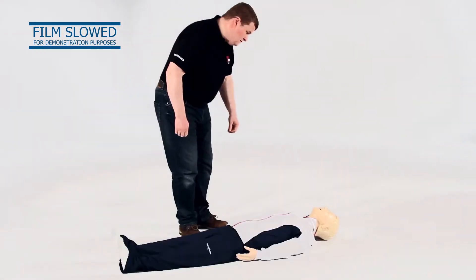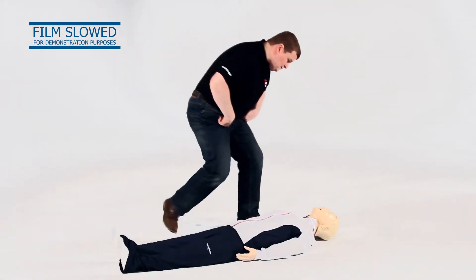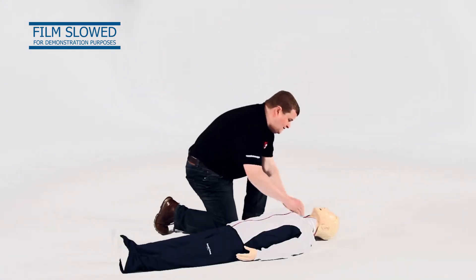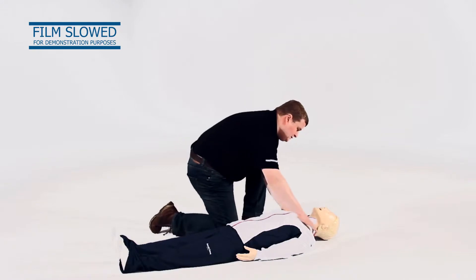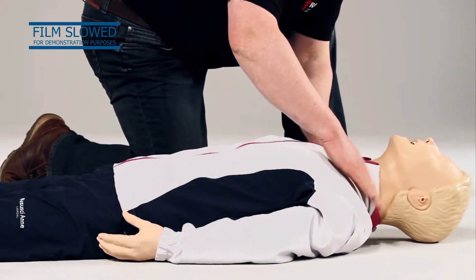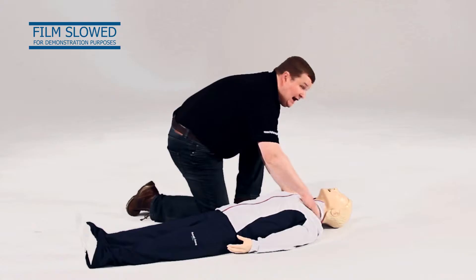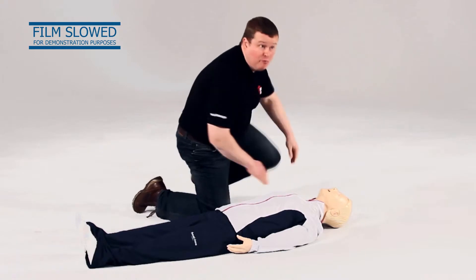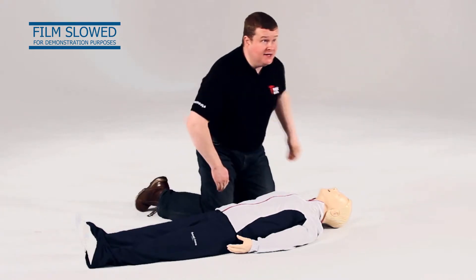Carefully assess to see if the casualty is responsive by shouting at them: 'Are you alright?' and by gently shaking them on their shoulders. If the casualty does not respond, shout for help.